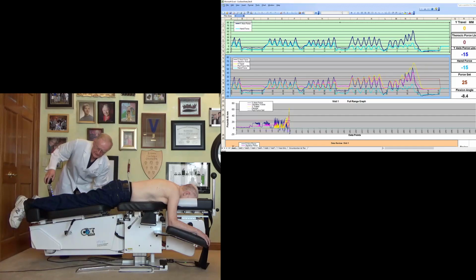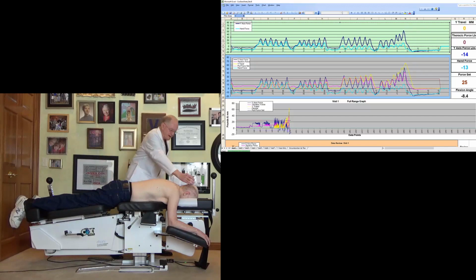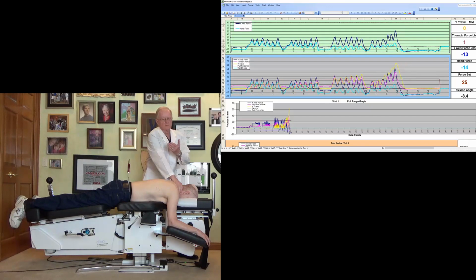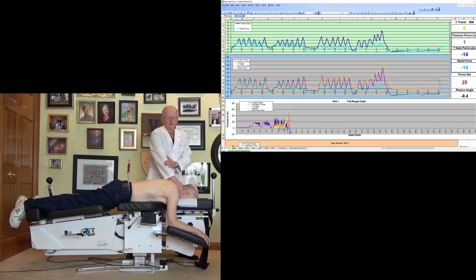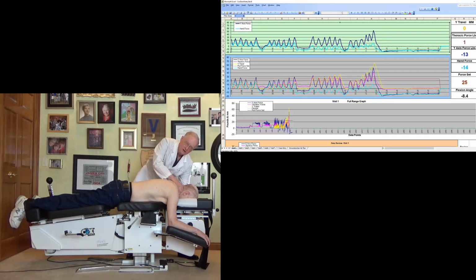So I'm going to lock the instrument here. I'm going to move to the cervical spine. In the cervical spine, when we teach you, we use the foramen magnum pump and C5 as the teaching tools to learn the difference between 2, 4, and 6 pounds of distraction.